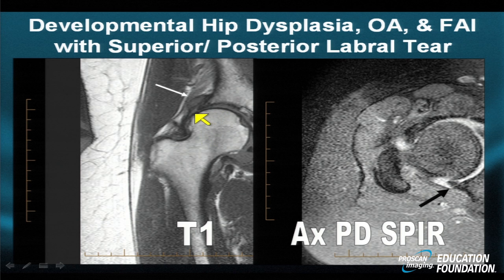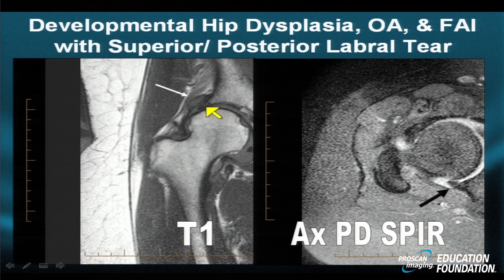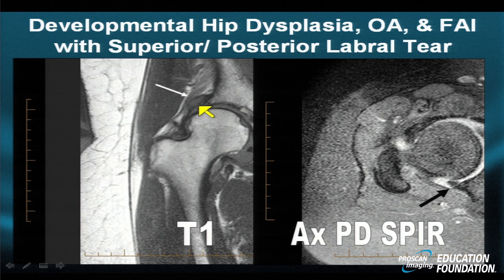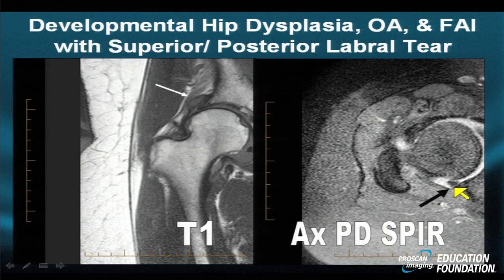Here's an example: the patient has a large femoral head — this is how they were born, it was dysplastic, a little too big for the acetabular cup, partially uncovered by the acetabular roof. This large spur contributes to abutment and restriction of motion every time the patient brings the leg up and in, and also in external rotation. A large area of scar tissue and blood has pervaded the femoral capsule, creating a large mass-like structure as a result of mechanical difficulty. In the axial projection, a small, very delicate slit-like tear is seen in the posterior labrum.